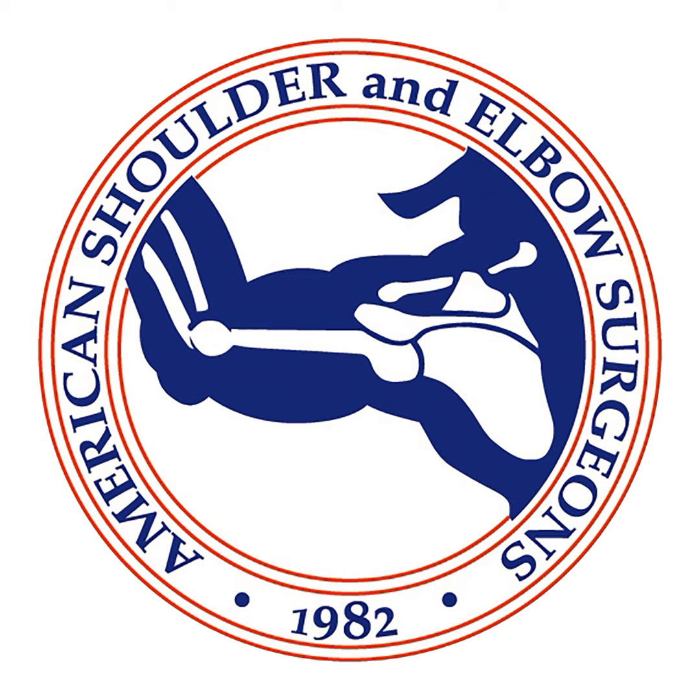One thing I see consistently with poorly done stemless arthroplasties is a varus neck cut. So it's really important, if you're going to do a freehand technique, that you get decent exposure and get all the osteophytes off, so you can define that native anatomic neck. And it's the old orthopedic adage, measure twice and cut once. Really take your time and make sure you get it right, because it's easy to mess it up.